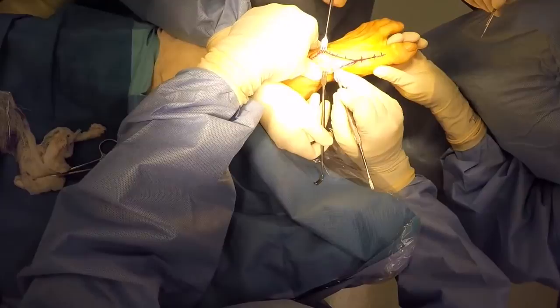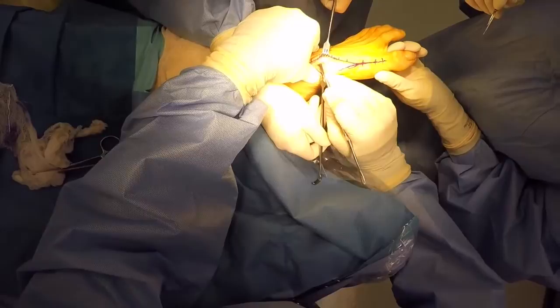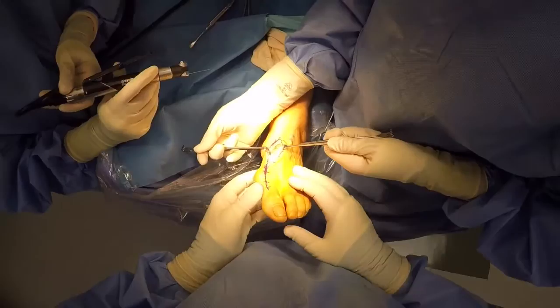So here we are dissecting our capsular and periosteal tissue from the joint. When you have significant arthrosis of this joint, particularly dorsally, which happens in patients with cavus feet or midfoot jamming pathologies, this can be a little bit of a difficult exposure.